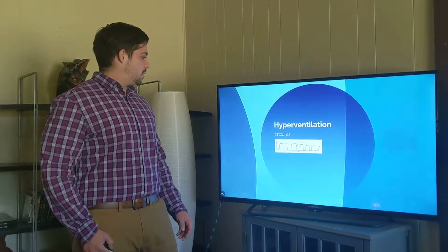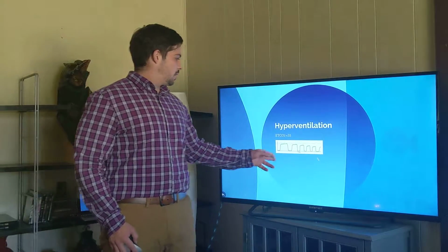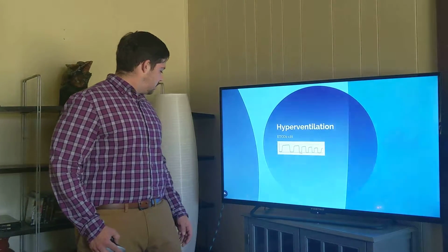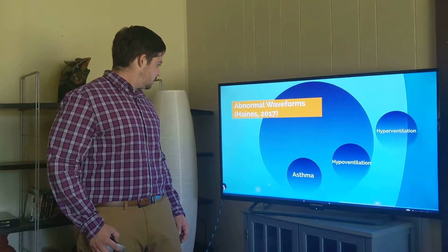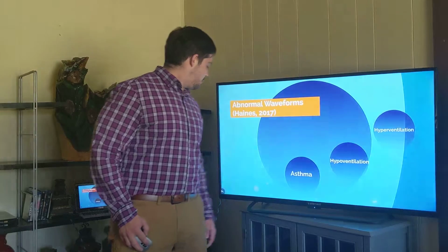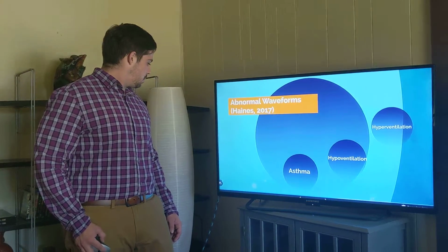When you begin to hyperventilate, your CO2 lowers. You'll see an increase in the respirations, and then a slow decrease in your end tidal reading. So our primary concern with the PCA pump is going to most likely be hypoventilation due to sedation and apnea.